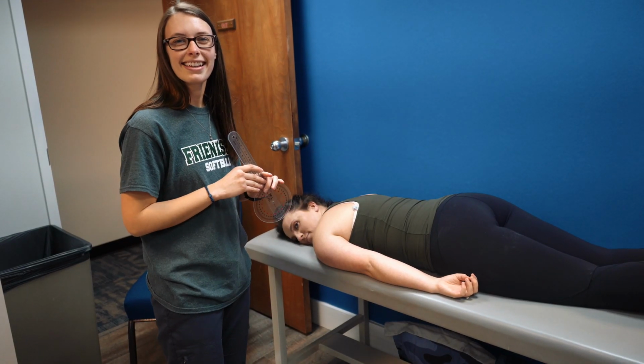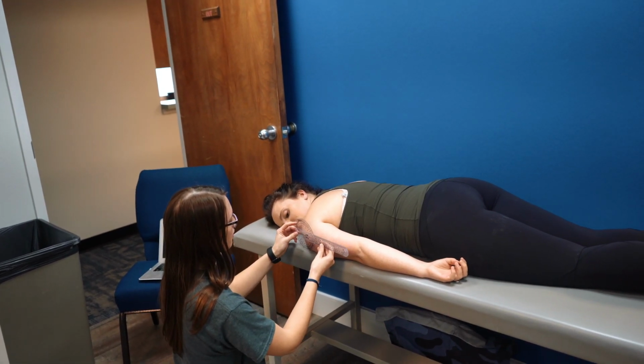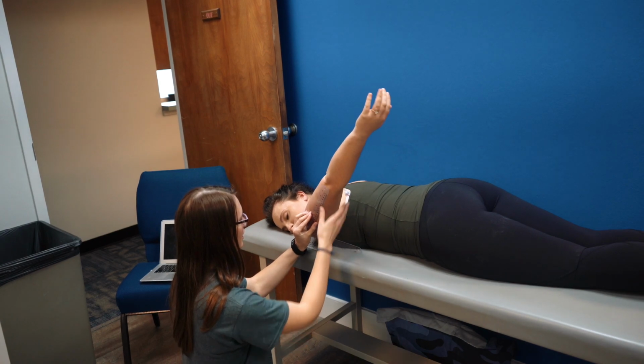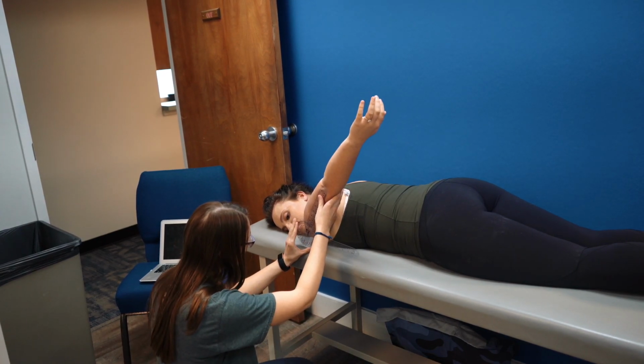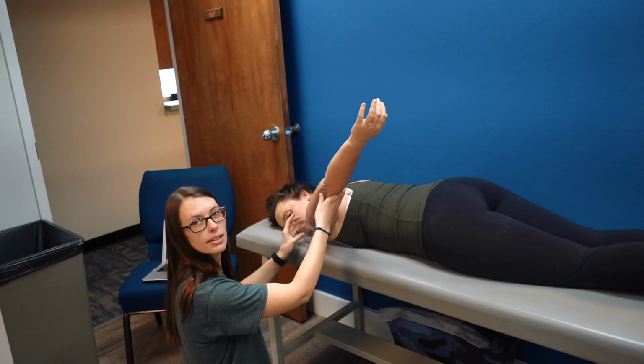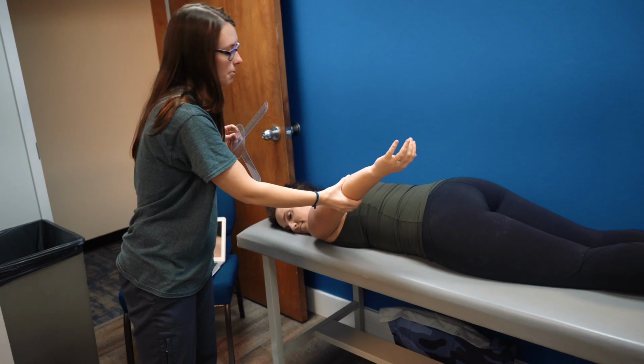I'm testing Kennedy's shoulder extension today. So I'm going to line the fulcrum up to her shoulder, and lift up for me, please. So she's actually at 60, and we aligned the moving arm to the lateral epicondyle. And she's at 60, so that means that she's within normal range.